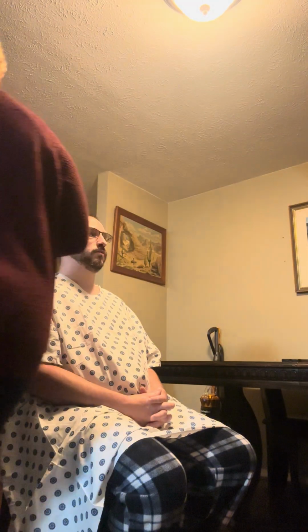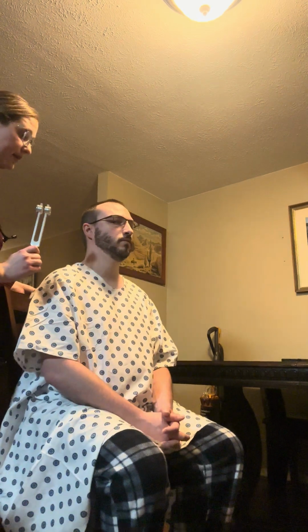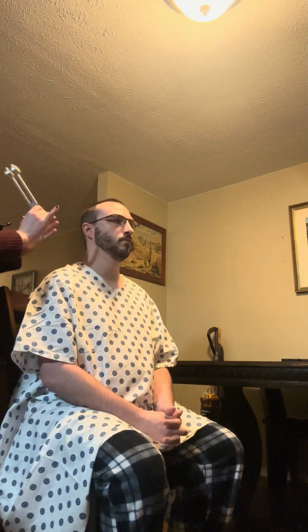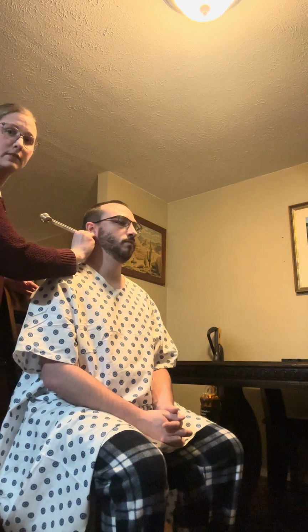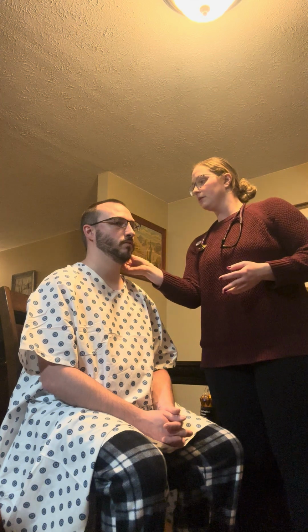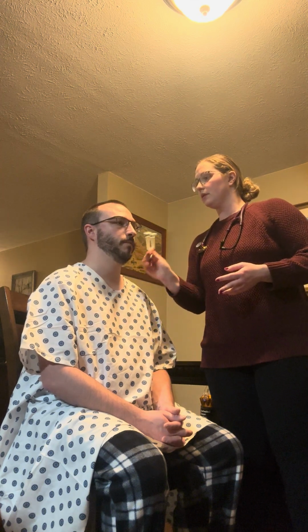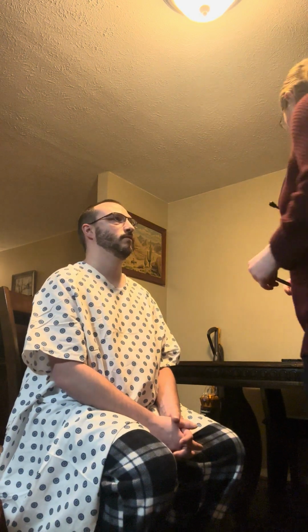Now I'm going to take the tuning fork, strike it, and put it right behind the back of your right ear. You let me know when you don't feel the vibration anymore, and then you tell me if you can still hear the noise, okay? It's gone. Can you still hear it? And I'm going to do that on the left ear. Gone. Yep. Okay, so air conduction is greater than bone conduction, so that means that cranial nerve number 8 is intact.